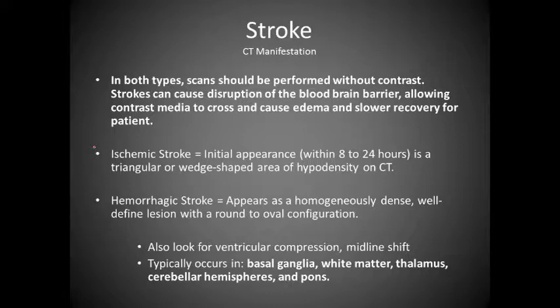And because of this, you might actually increase intracranial pressure, and this can cause a vast array of problems with the patient, or even further enhance what's going on. And so we ultimately don't want to impede the progress of the patient. So this can result in a slower recovery for the patient, and we don't want that. So if a stroke is suspected, do not perform with contrast until you get an opinion by the radiologist.